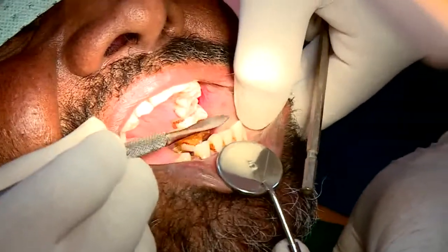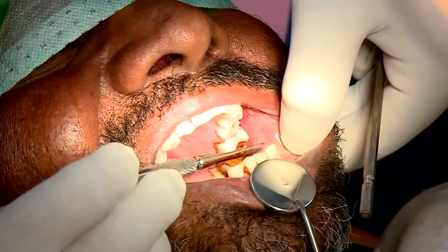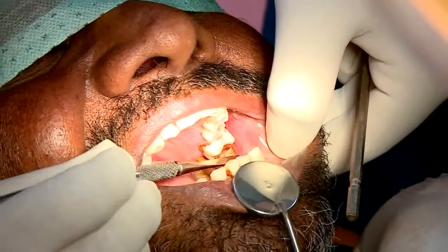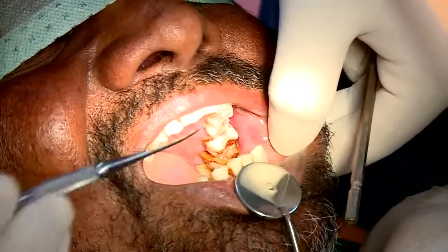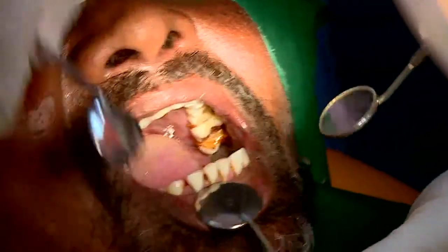So that's the fibrous area. So we are going to make a wedge-shaped lesion in this area. The specimen will include mucosa, submucosa of normal mucosa, as well as the mucosa, submucosa of the fibrous area.